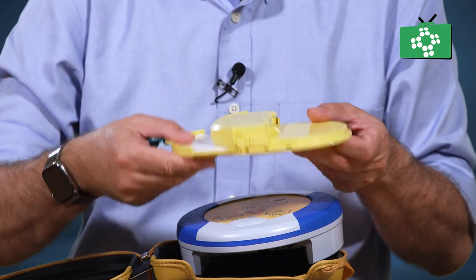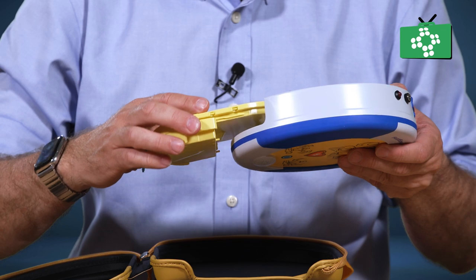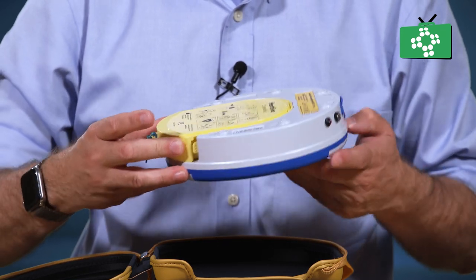Check the expiry dates and check the battery expiry dates. Look at the unit itself and make sure there are no signs of damage.